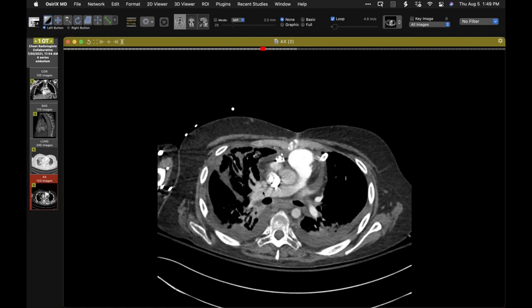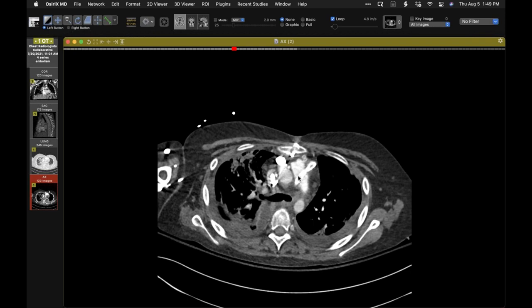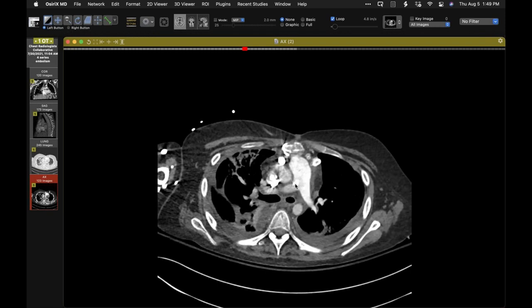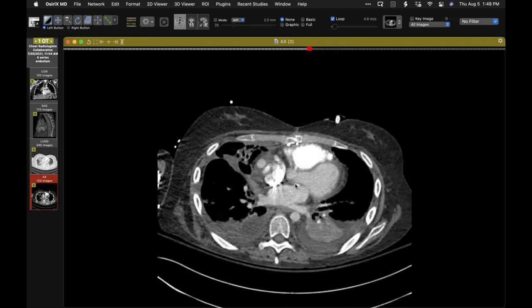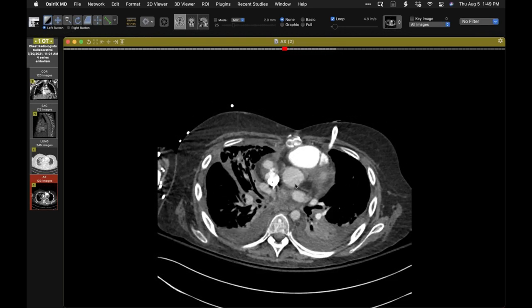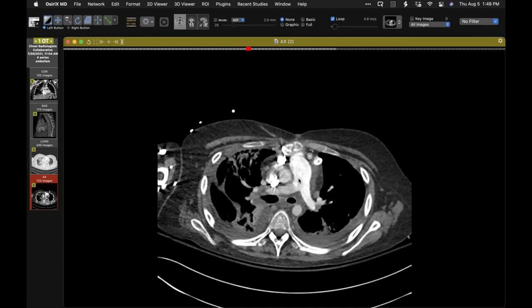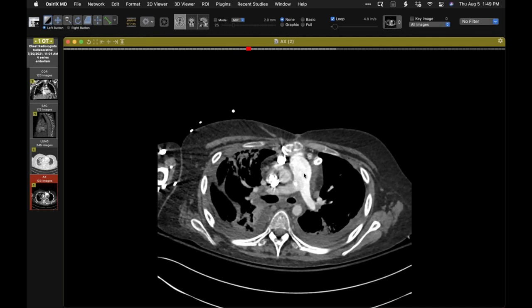So as you may have seen already, we do have a device in the left pulmonary artery, the tip of which ends up right there. So this is a patient with extracorporeal right ventricular assistance. Blood is being taken out of the right atrium, there's the atrial cannula, pumped outside of the body and delivered back via this cannula to the pulmonary artery right there. Of course the blood coming back from this cannula doesn't contain the kind of contrast medium delivered via the superior vena cava. It's kind of diluting the contrast medium out.